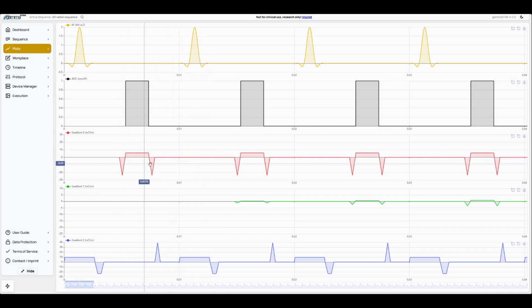The difference between this type of sequence and the flash sequence now is that it's not like having individual encodings on the y-axis which select the Cartesian line and then having a readout which reads out always the same line in x direction.